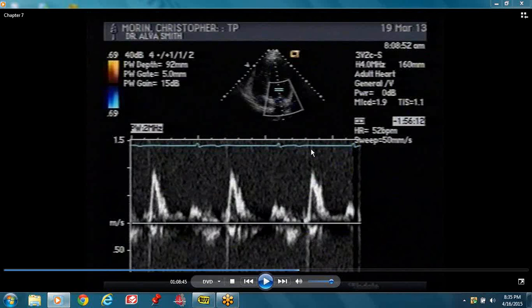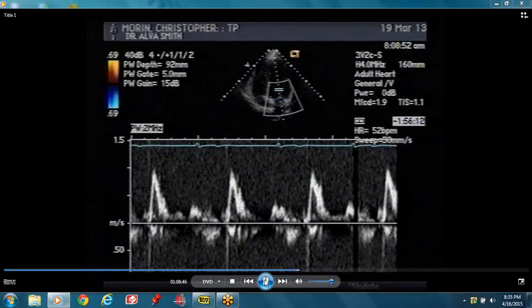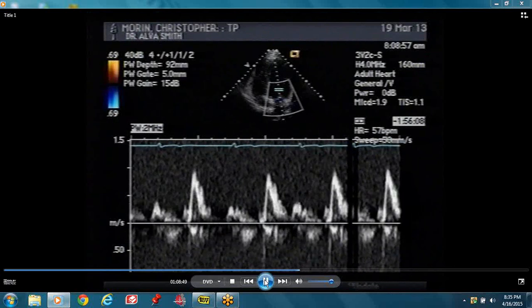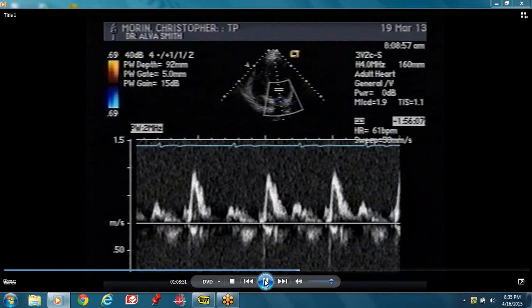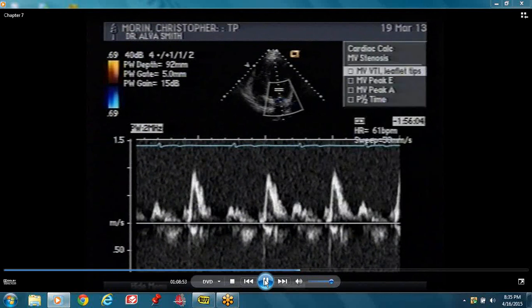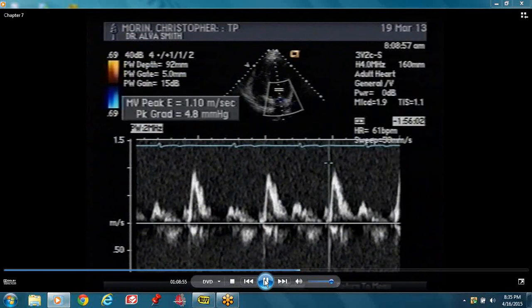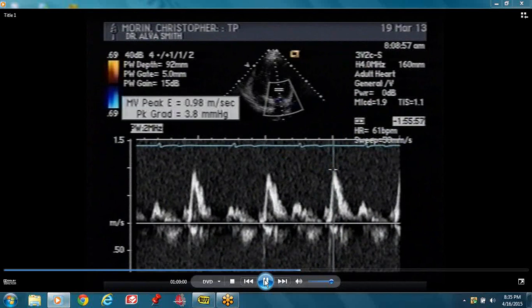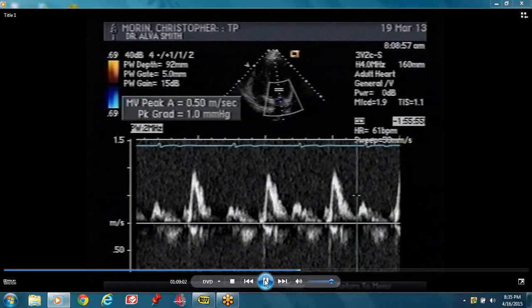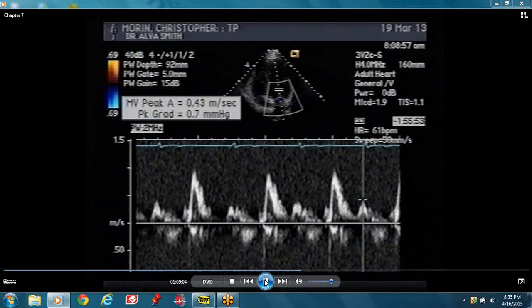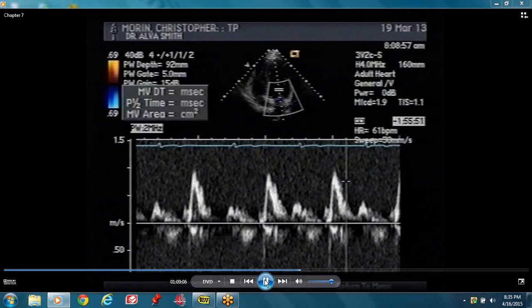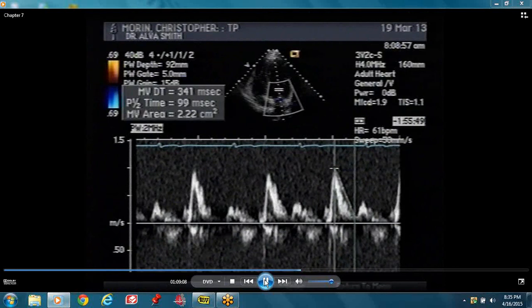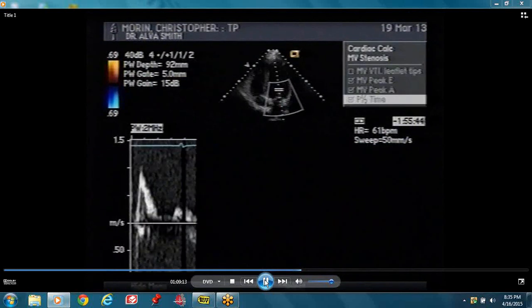Everything is gated to the ECG. You always have to measure your E-velocity — measure the velocity. E-velocity, deceleration time, and A-velocity. The deceleration time is from peak E to the baseline.